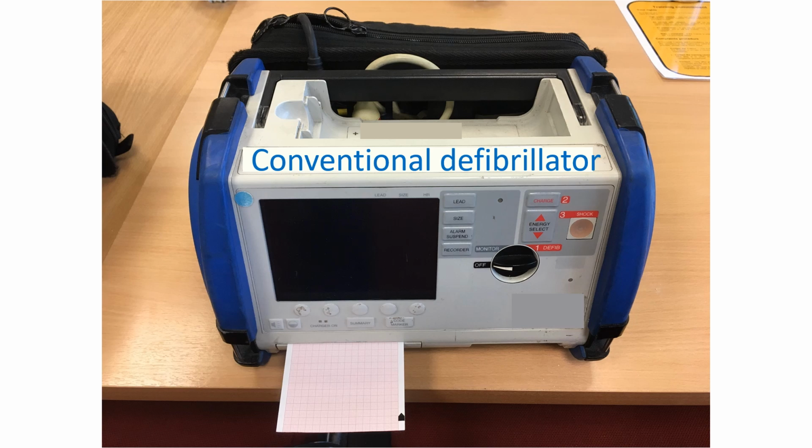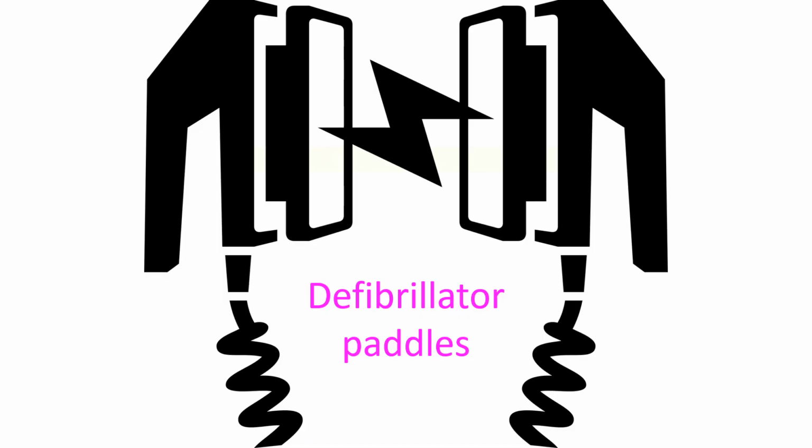In a conventional defibrillator, as automatic rhythm analysis is not available, the trained operator has to decide whether a shock is advisable or not. But most modern defibrillators also have an AED mode for emergency use. Proper application of patches or paddles is necessary.